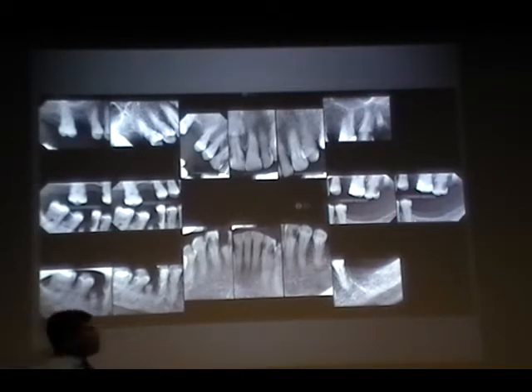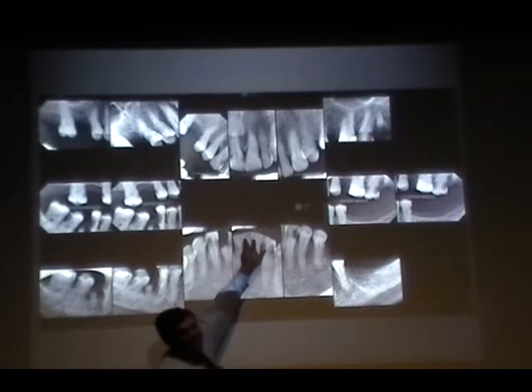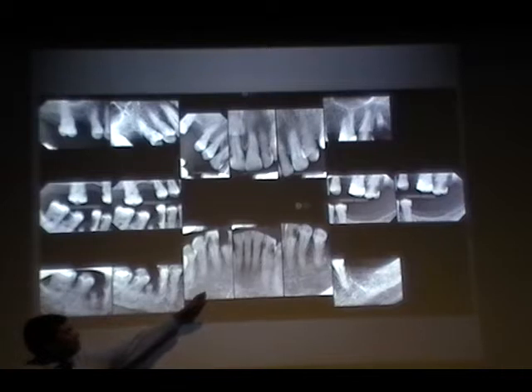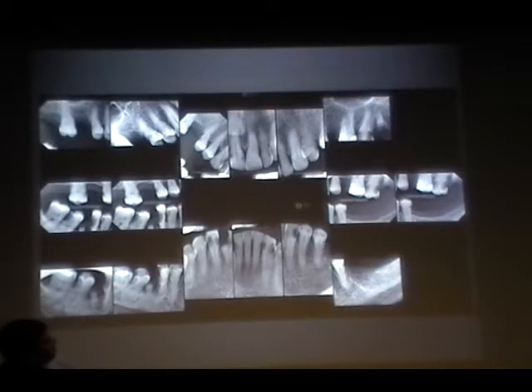Okay. It's fine. There's no open contact. And also, what happened there? Can you open contacts there? Or the patient is having malocclusion? Lisha, so the sensor, there's no open contact between the lateral, actually there is, between the lateral and the canine.